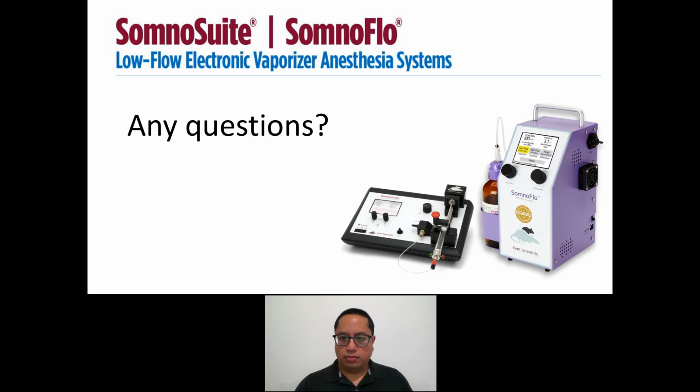Next question here from Elle: is it possible to have anesthesia flowing to both the induction chamber and the nose cone at the same time using the Somno Suite system, as there are two different buttons for it? Hi, Elle. Nice to meet you. On the Somno Suite, as well as the Somno Flow, we have two different buttons for either the high flow or the low flow, or for your induction chamber and your face mask. All those buttons do is act as presets for the flow rate that you assign to them. You could go into the setup menu and assign a flow rate to each of those buttons.